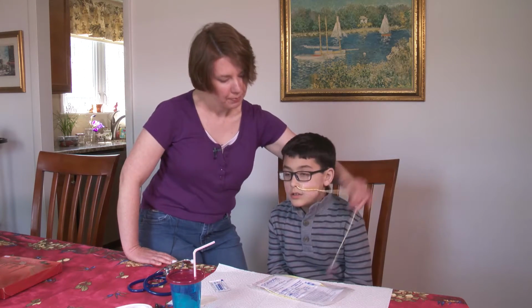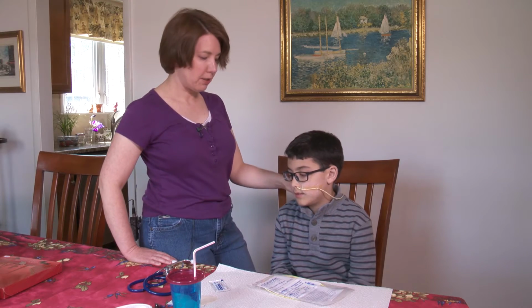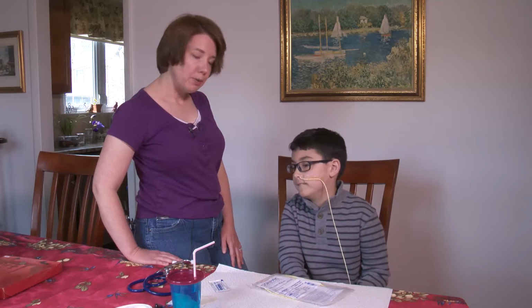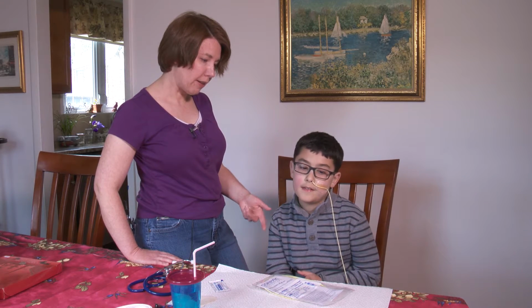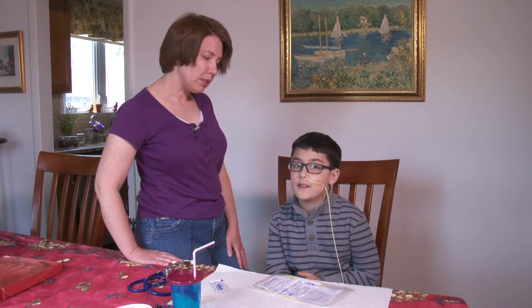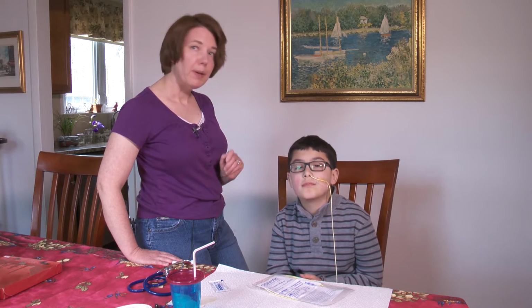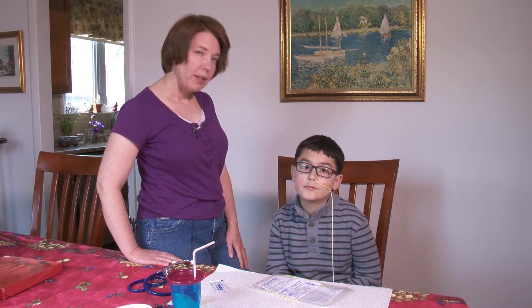We just tape it to the back of Noah's shirt during the day when he's not using it, and then it doesn't bother him. So Noah told me that it really helped him a lot when he was learning to put in his tube. We watched some YouTube videos of some other kids. There was Natalie and Zach and Josh, and we really appreciated their help because they showed us how they put in their NG tube, and it helped us learn how to do it.